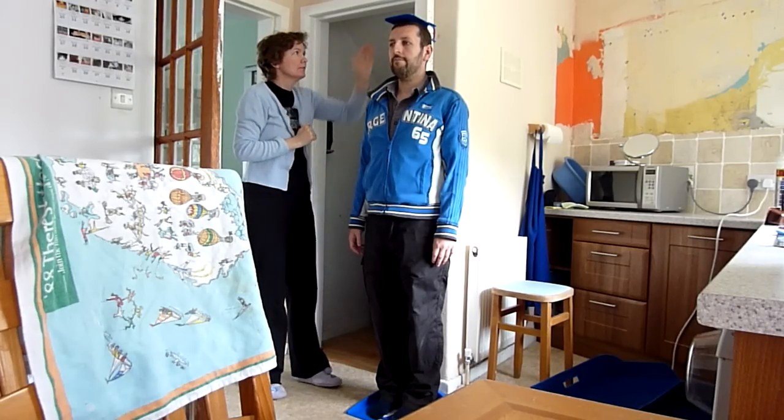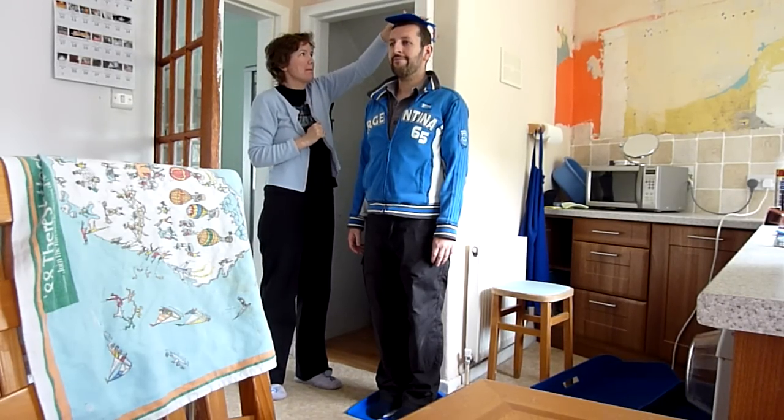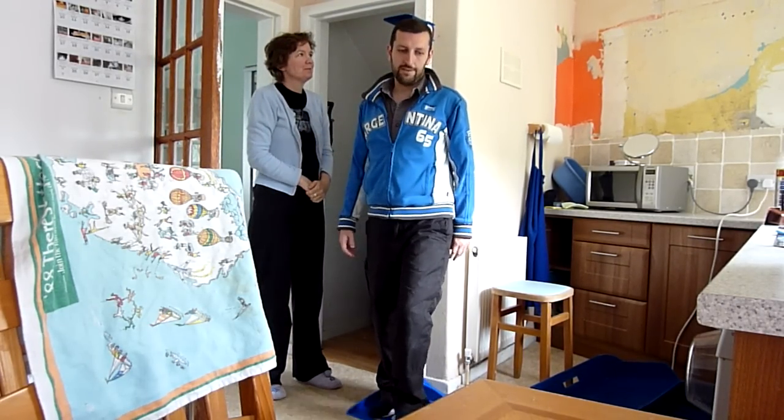I should really bash it down. Just need to knock my sock off there.